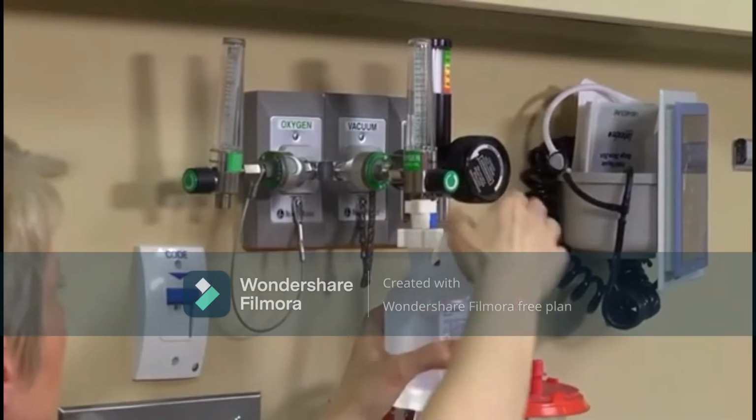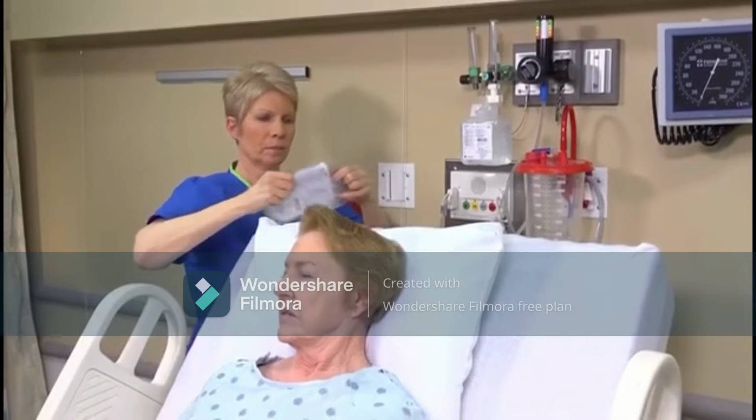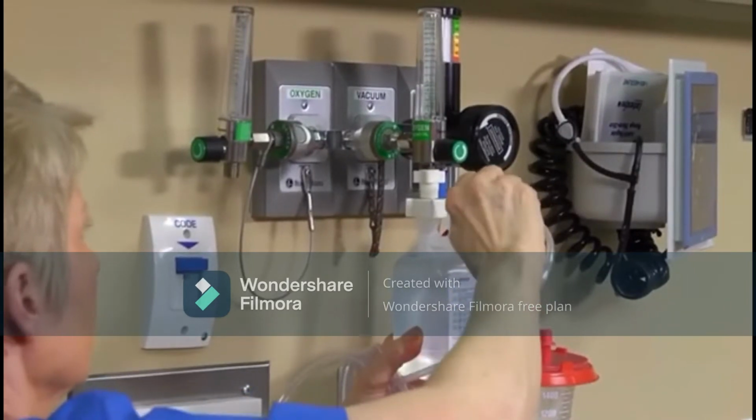Then attach the oxygen delivery device, that is, the cannula or mask, to the oxygen. If the ordered flow rate is greater than 4 liters per minute, be sure humidification is attached.